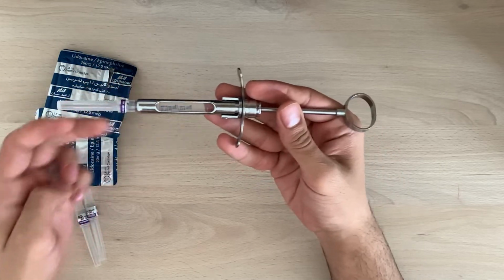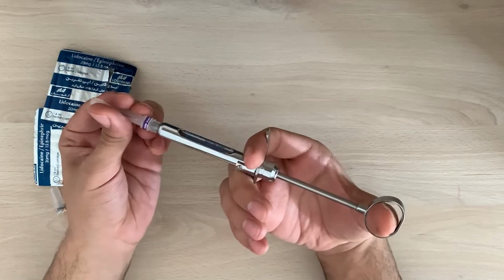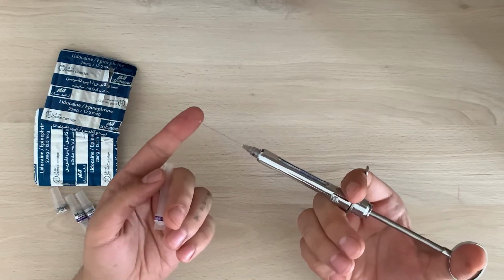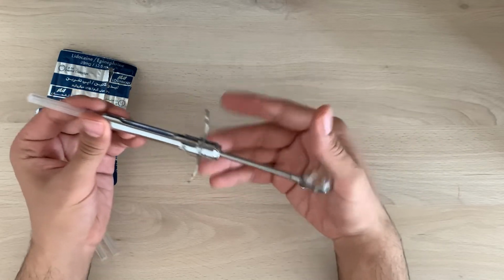And now let's try it to see if the syringe works properly. And now we can do our injection.